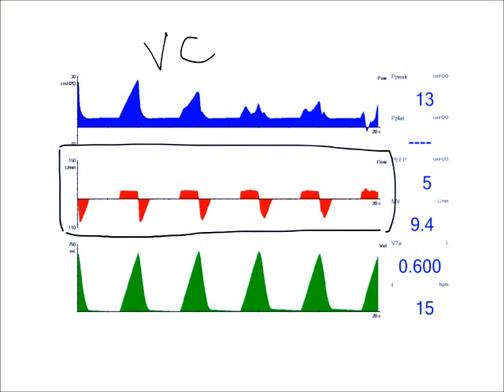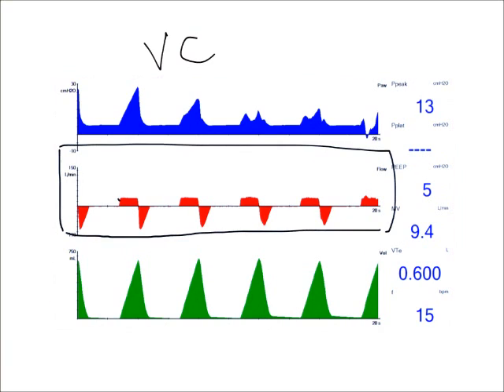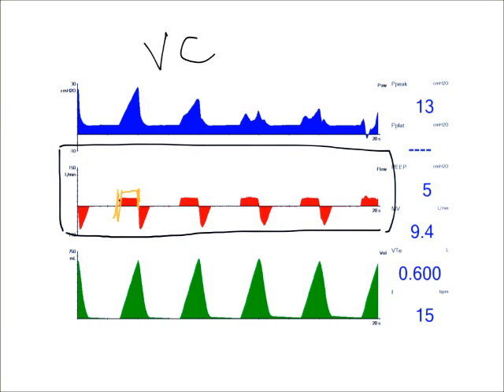So my inspiratory time is actually, I have the beginning of my inspiratory flow, so it starts here, right there. It's kind of hard to see, so I'm just going to change colors. So starting right here, as you can see, the rise of flow, and then it stops here. So this is the beginning of my expiratory flow. So that whole area is my inspiratory time.